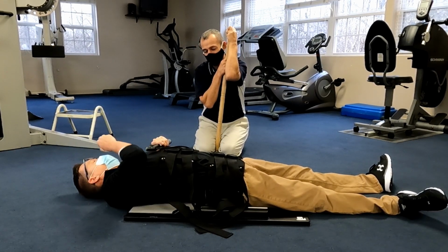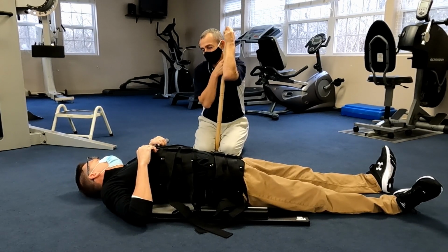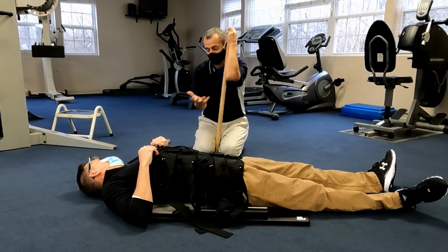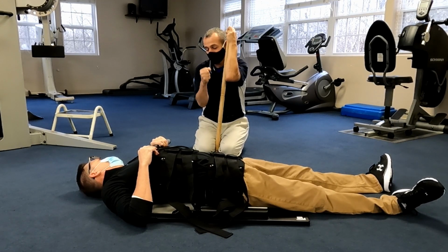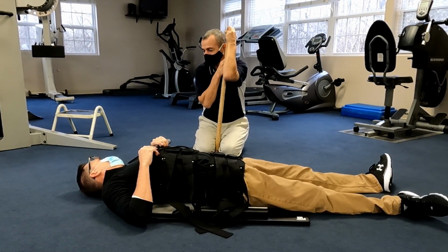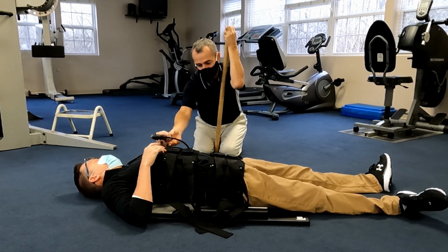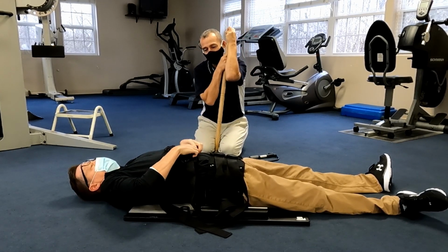There's absolutely an opportunity to have a couple of these that are out on lease, because a client's not going to necessarily need this for 20 years. Some do. Some have persistent chronic conditions. Some have acute flare-ups, a flare-up that's going to last 2 to 6 weeks. They can rent a unit like this. They can use it at home. When they're done, they get it out of the house, and then somebody else can benefit from it. Go ahead and unhook yourself, and let's see you roll to the side, and then we'll come off of there.